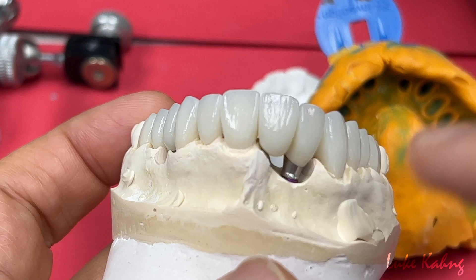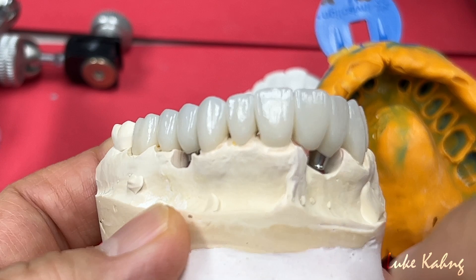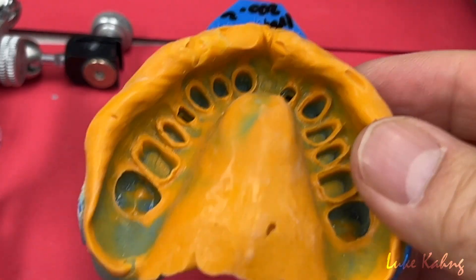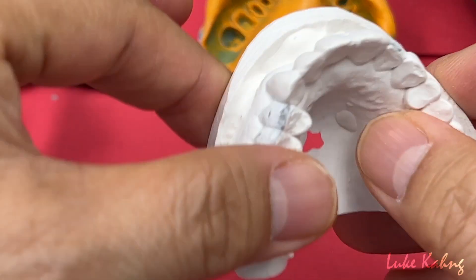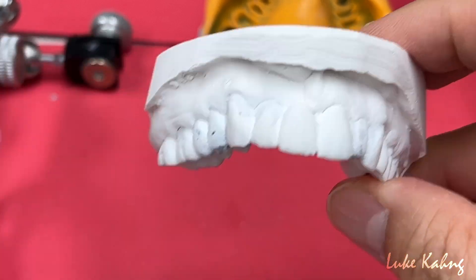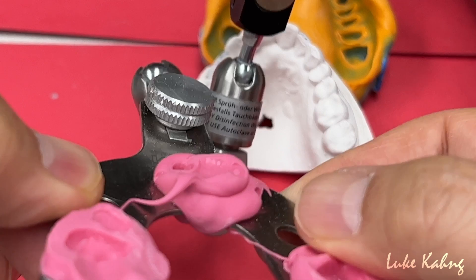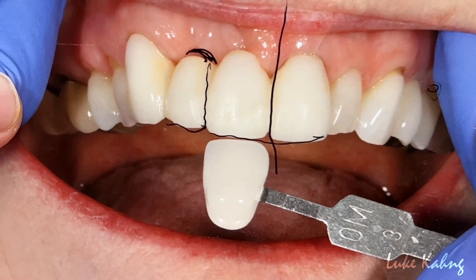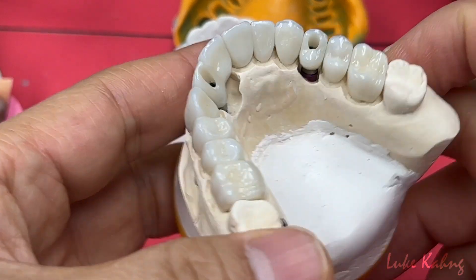Doctor, we're going to follow it — same as here, little bit. So from the great impressions, he does great job. He did two impressions. He gave us the study model, which is guidance. He gave us the same articulations. Here is the photo. Here is our final restorations.